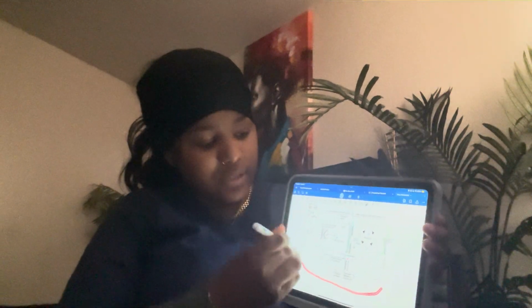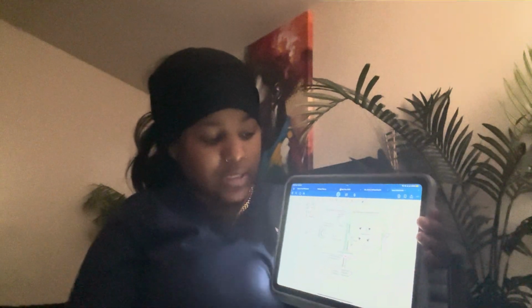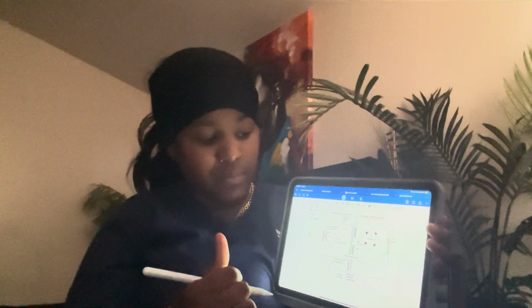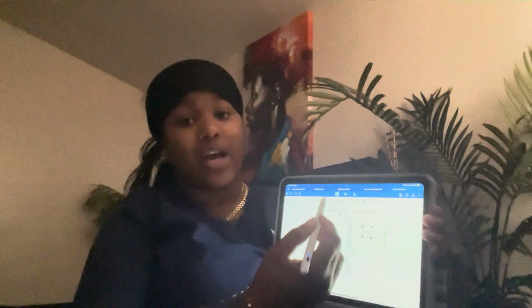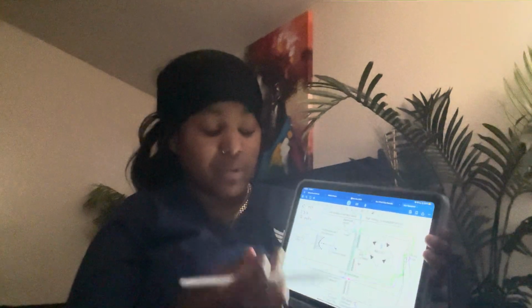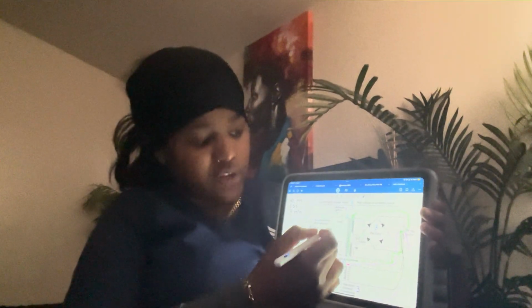So it's very important to ensure that when you are holding the exposure switch, it is held for a good enough duration so that the exposure is actually complete. Because if you let go and the exposure is not complete, we can possibly damage and reduce the life of the entire X-ray circuit, which includes the machine. So this is a very important part. The switch is what completes the electrical circuit, allowing the high voltage kVp to flow to the X-ray tube.